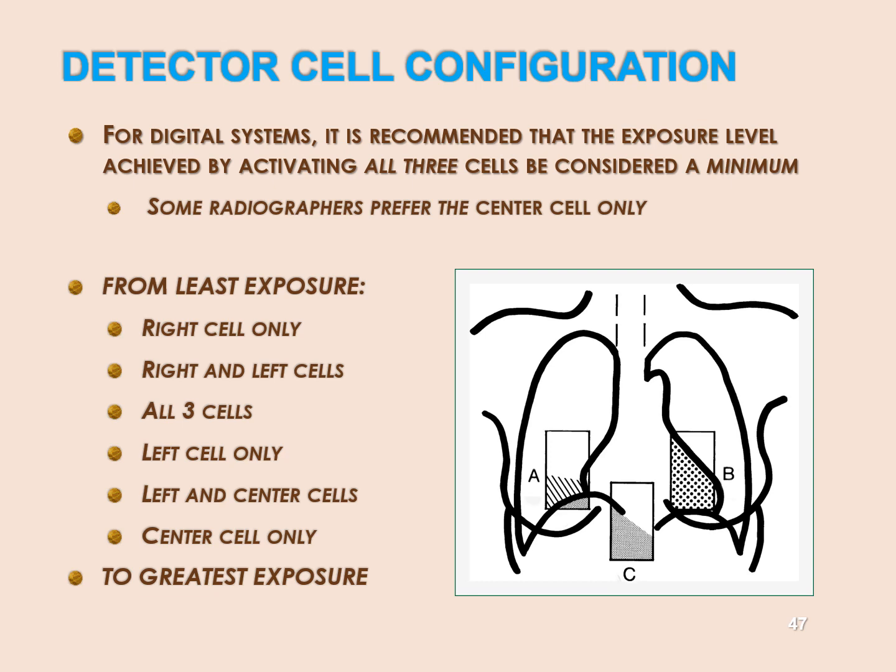All right, so this is it. This is his, right? For me, my criticism is his chambers are out of scale with the size of the lung fields. Okay. Remember, the chambers are only about 1 inch across, 2 inches long. All right. So that means that lung is only 7 inches from top to bottom. That's ridiculous. Lungs are not 7 inches from top to bottom. Lungs are more like 14 to 15 inches top to bottom. Okay, so he's got a very tiny person here.